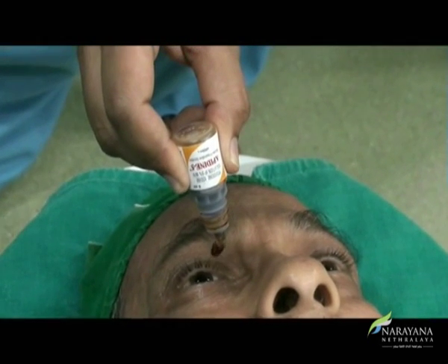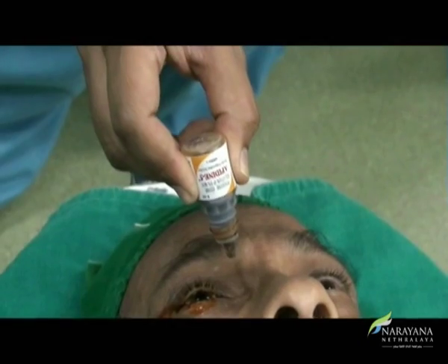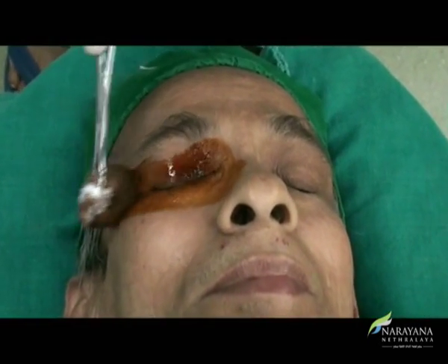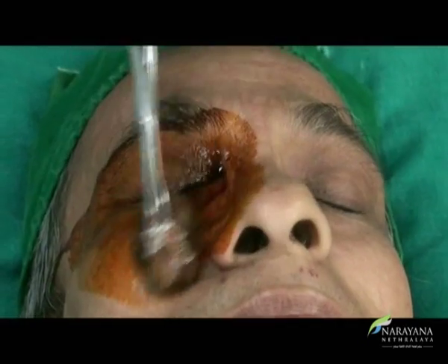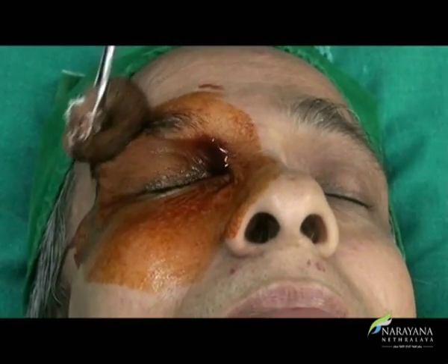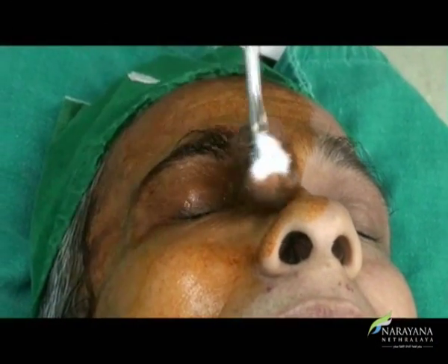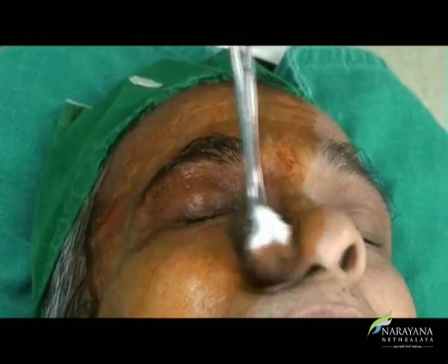A drop of proparacaine and 5% povidone-iodine solution is instilled at least 5 minutes prior to the procedure. Painting of the eye is an art — it should be carefully cleaned till the bridge of nose, brows, forehead, and cheek till the maxillary line, and after painting twice it is left to dry before wiping.